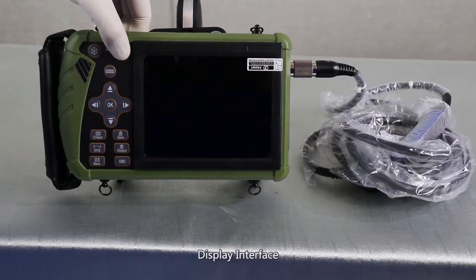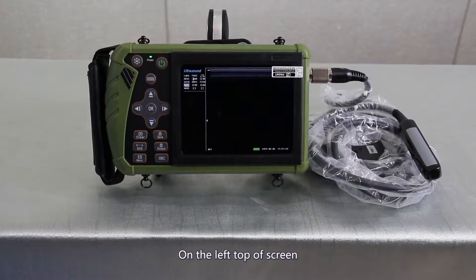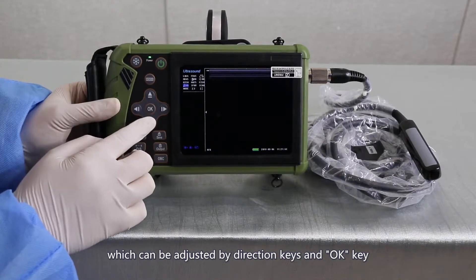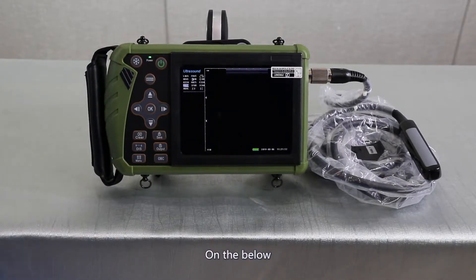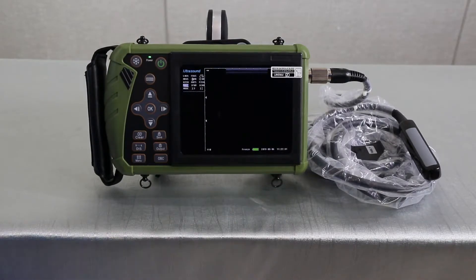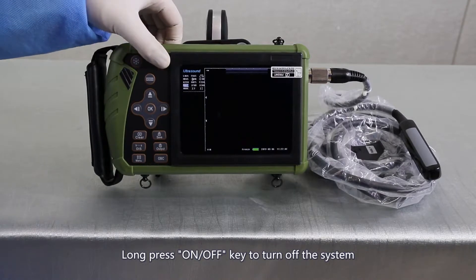Display interface. Long press the on-off key to enter into the operating system. On the left top of the screen there are current parameters, which can be adjusted by the direction keys and OK key. On the bottom is the depth, current workstation, current battery level, date, and time. When the battery is low, please shut down and charge it. Long press the on-off key to turn off the system.